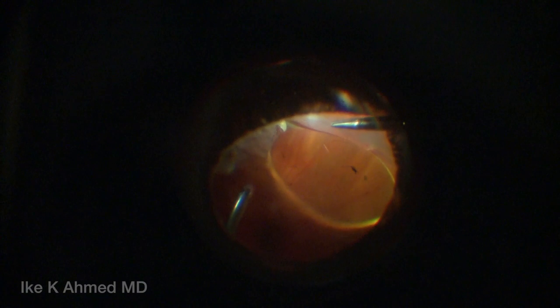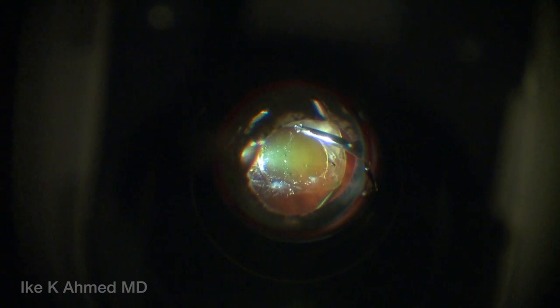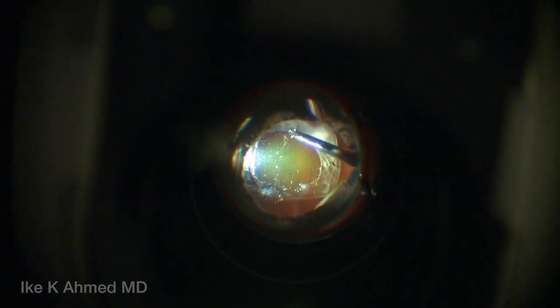It's important to ensure that the IOL is free of any vitreous attachments. We can do this by watching both the stained vitreous as well as observing for any movement of the IOL as the cutter is placed around the IOL capsular bag complex. We've pretty well completed our anterior vitrectomy. The posterior infusion line and the illumination system are certainly helpful here. We find that the pars plana infusion line is beneficial even from an anterior segment perspective, as corneal infusion creates more turbulence and distorts the cornea with striations. We have now essentially completed the anterior core vitrectomy around the IOL.